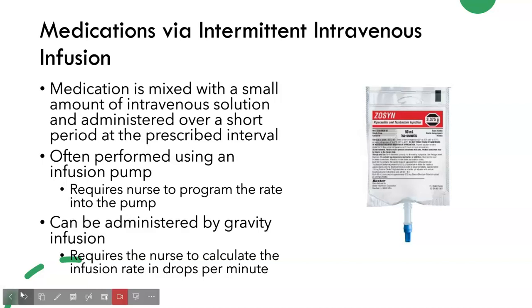So there's all sorts of different medications that are given this way, so it's important that we know how to give them. So this is just a medication that's given in a small amount of IV solution and is administered over a short period at the prescribed interval. So this is when we're going to use a pump.